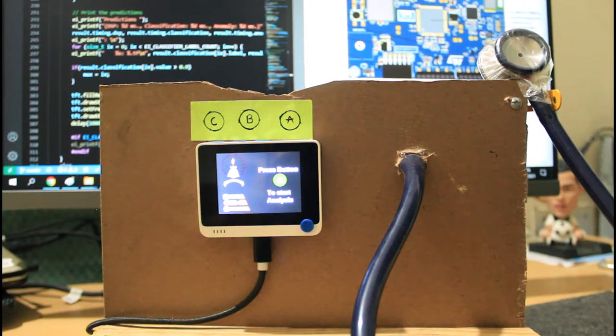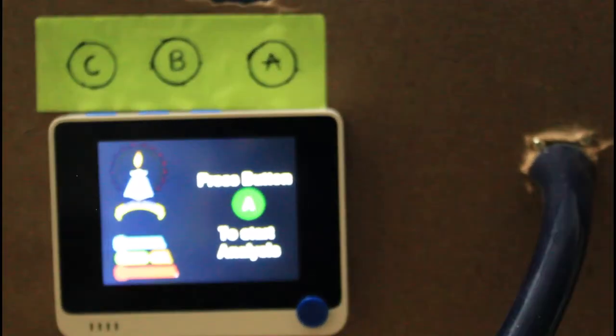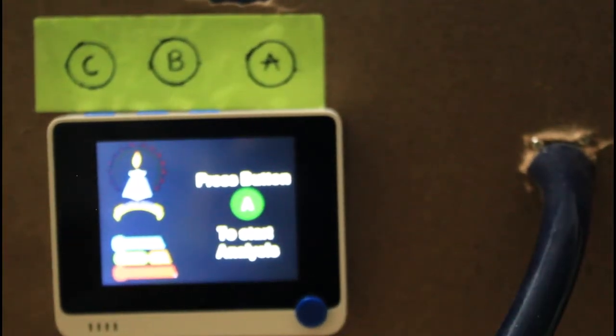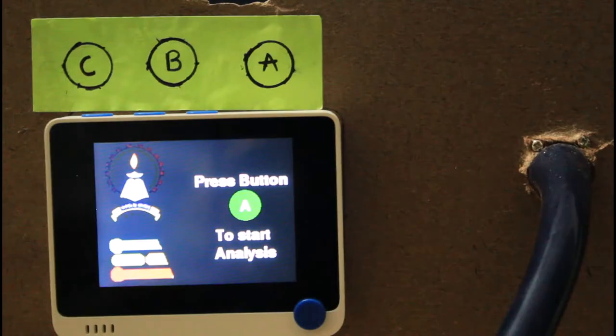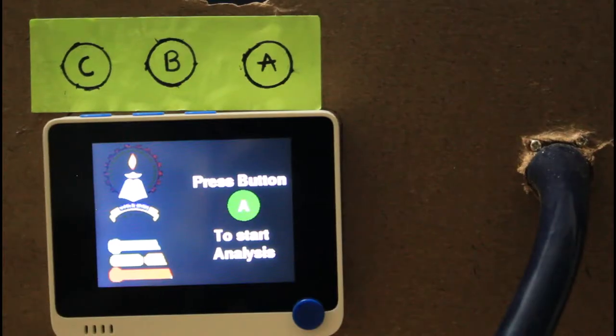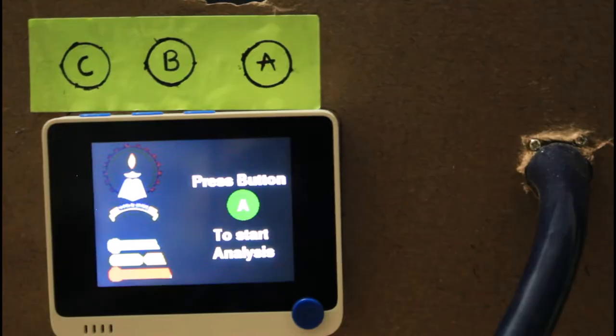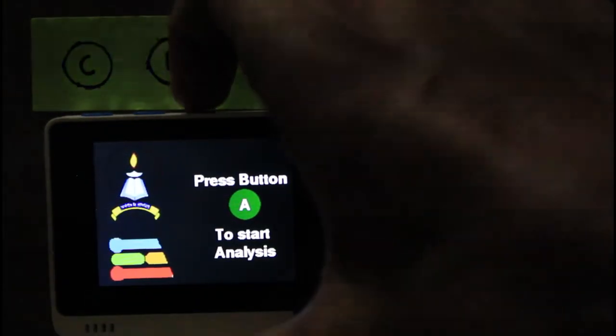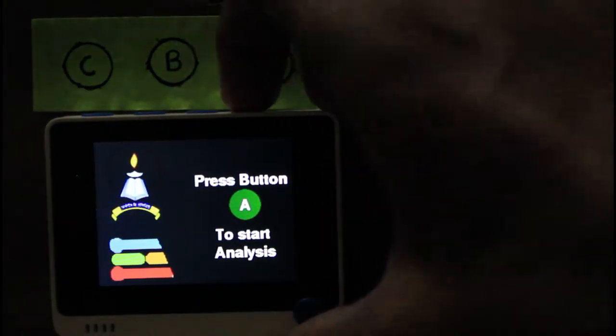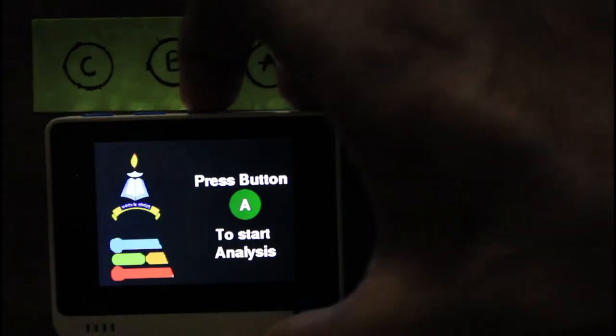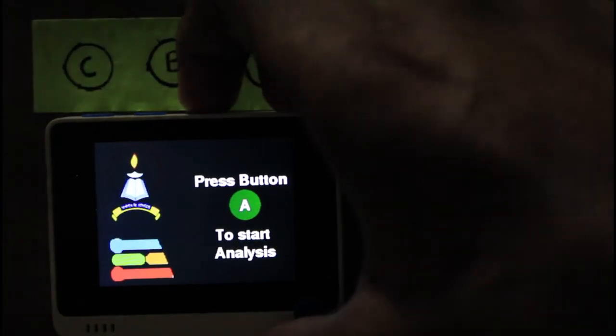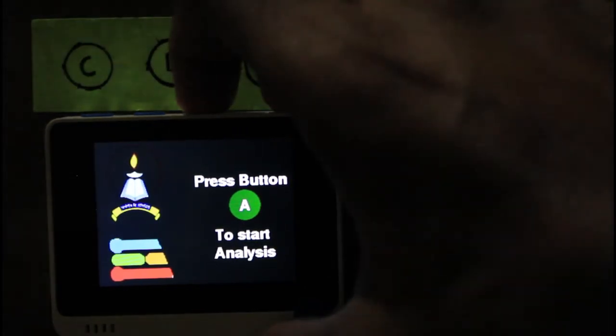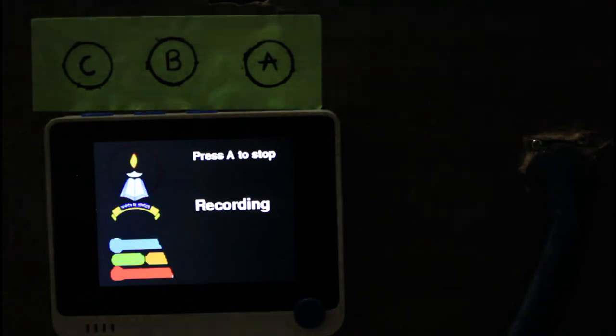We need to press the A button on the wire terminal in order to start the analysis. Once we do that, it would start listening for the lung sound through the microphone connected to the stethoscope.